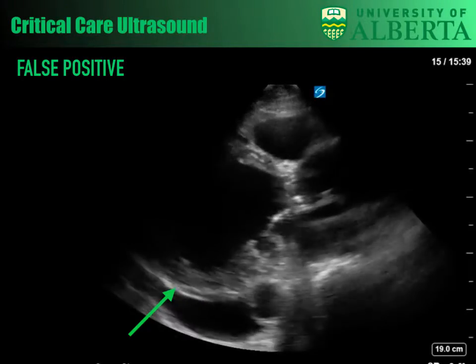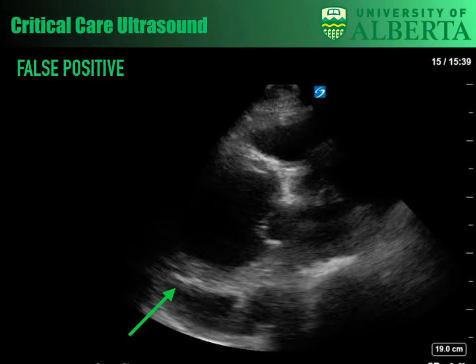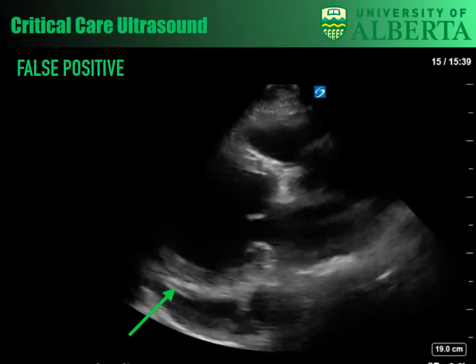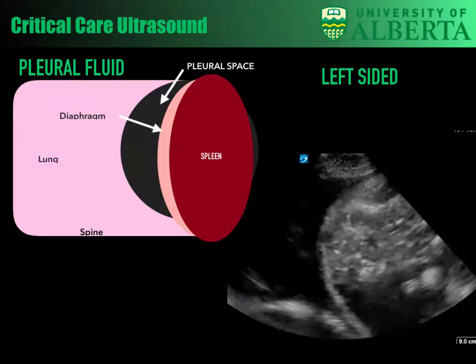Yes, and so there's the pleural effusion, and there's the pericardial. It's very, very small. Again, it obeys those laws where it goes posterior to the thoracic aorta, and we don't see much anterior to the RV or RVOT. There's your normal reference. Again, keep that in mind, you can look for that pleural effusion.